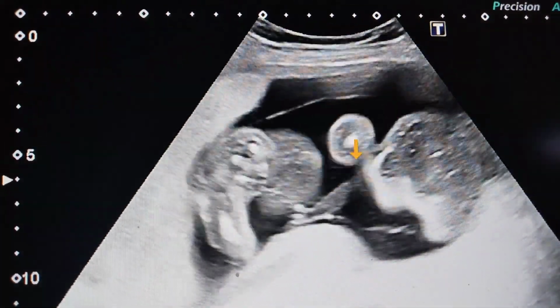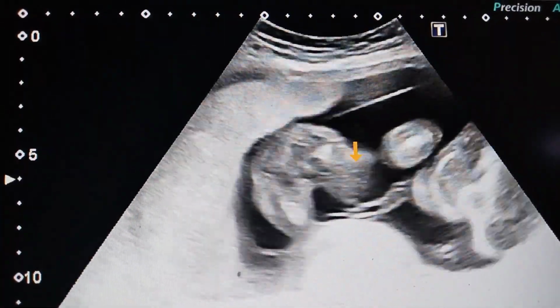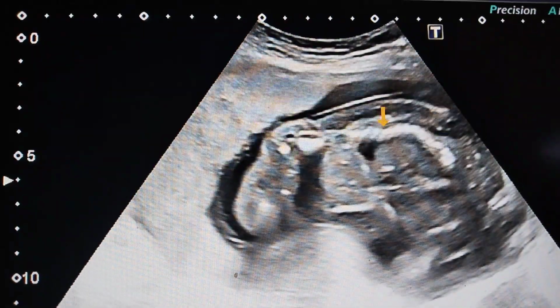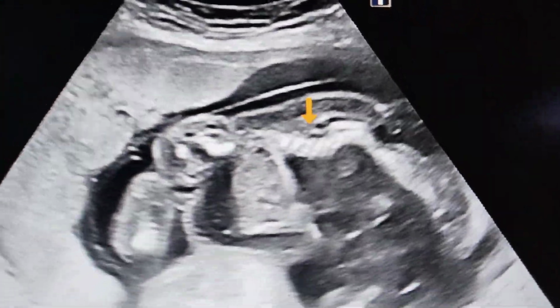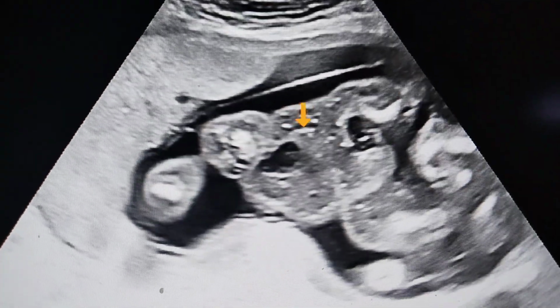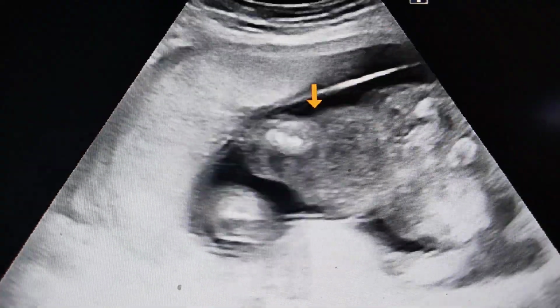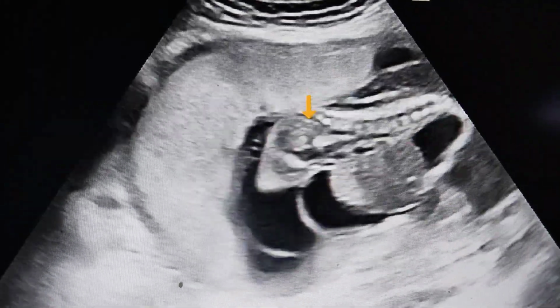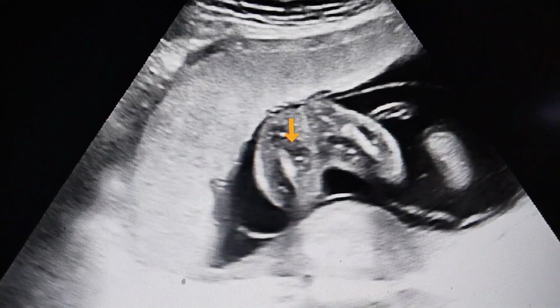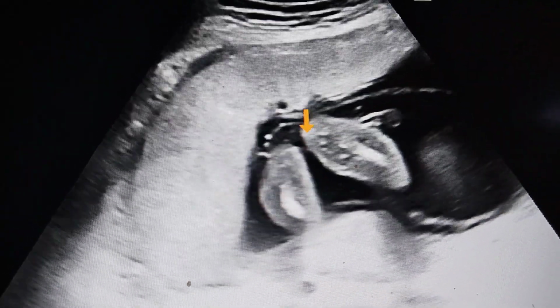And then when we drag the probe downward, we can appreciate also these hypoechoic areas, which is the subcutaneous edema, is also seen. And then this is the lower limb, that is also having the subcutaneous edema.